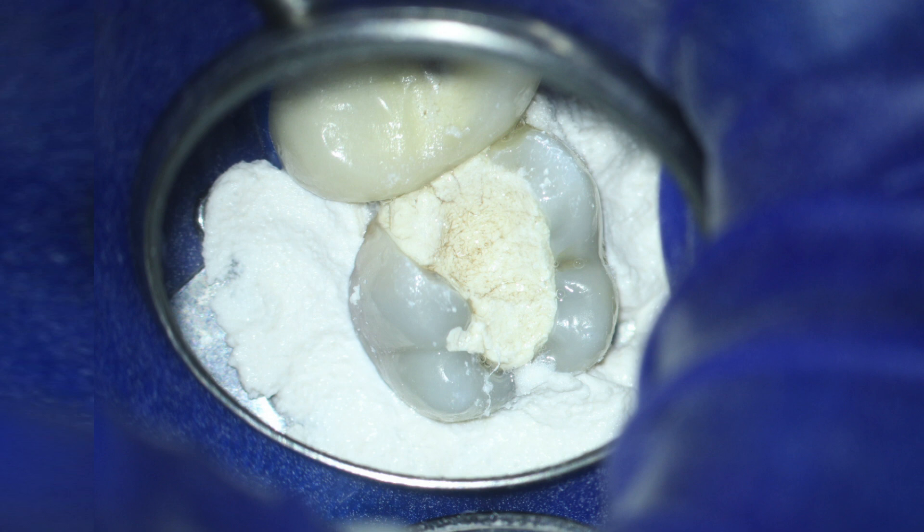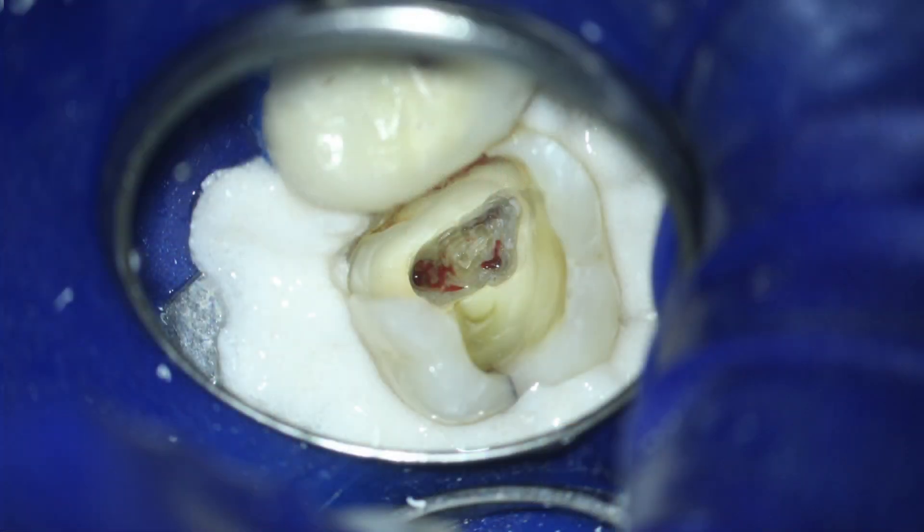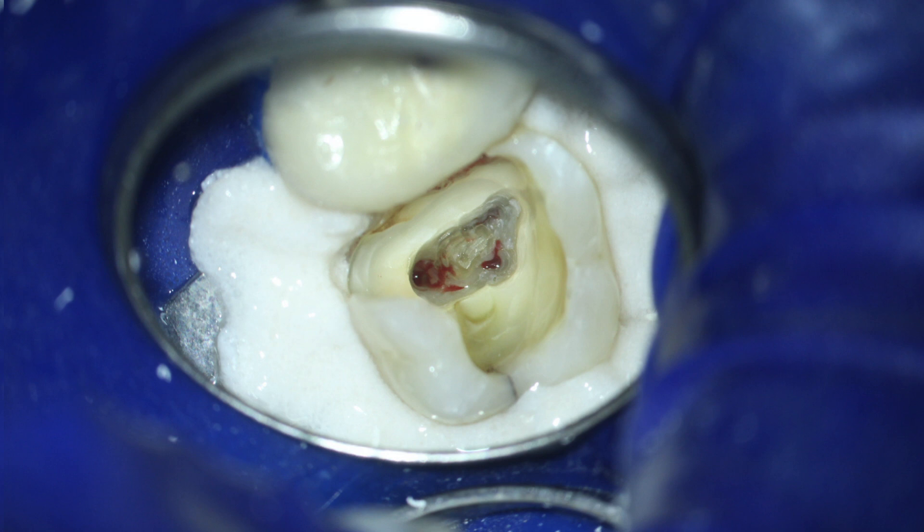So we apply proper anesthesia, test that anesthesia, and then get our aseptic isolation. For this particular treatment, I chose to use a single tooth isolation technique with rubber dam block-out material to really create that nice aseptic field. Clinically, looking at this tooth, we see that restorative material that showed up on the PA as more or less an IRM — some sort of intermediate restorative material. The challenge is how deep does this go and how is it related to the biologic width and the attachment. After the entire temporary restoration and residual caries are removed, we're confirming the fact that we're dealing with a vital pulp. We see the hemorrhaging within the root canal system confirming the vitality of this tooth, which is also consistent with the diagnosis of irreversible pulpitis.